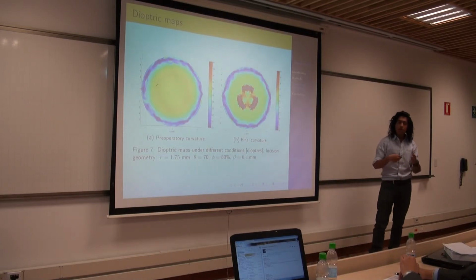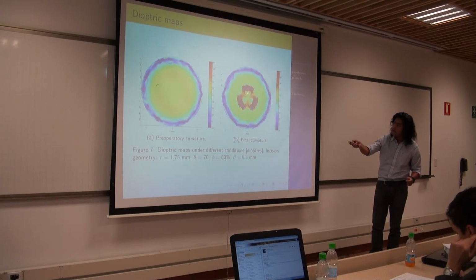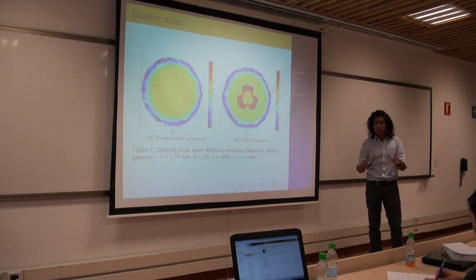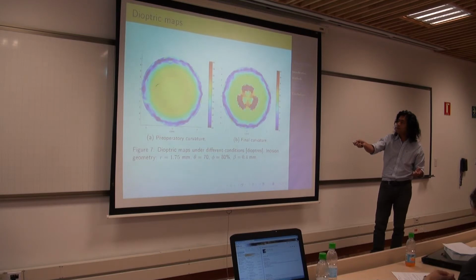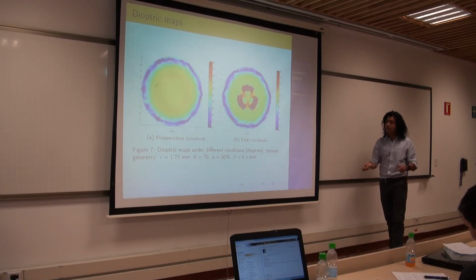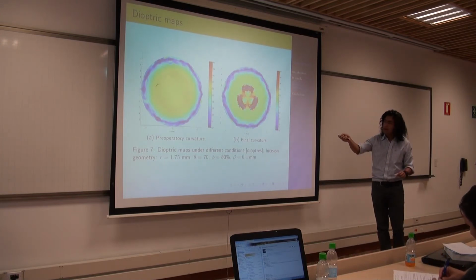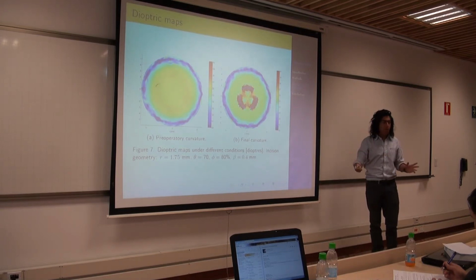And as I said before, in order to correct myopia, we need to flatten it. It means we need to have blue zones, as we have here, here, and here. And in order to correct presbyopia, we need curved regions, which are hot regions. And we see that with the surgery, we have hot regions, curved regions, as well as flattening regions. So the previous surgeries only account for one change, either flattening or curving. But we proposed and we obtained a multiple effect. That's right.